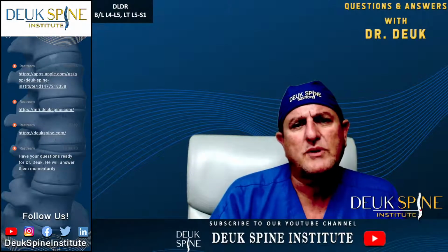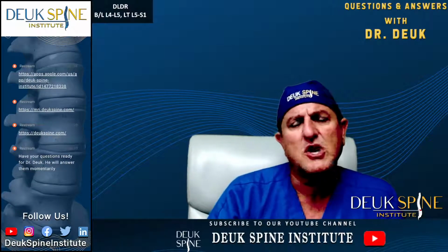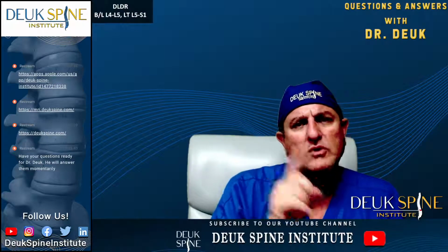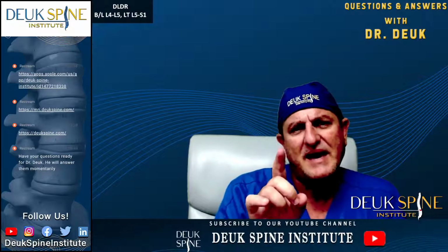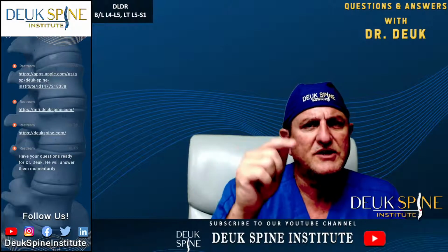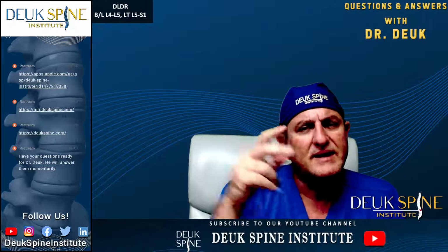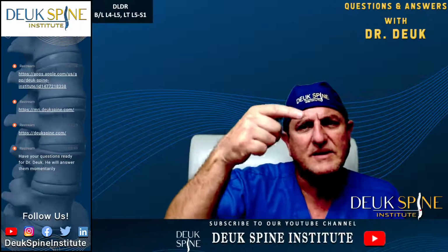We've treated now 20 patients with the Deuk laser disc repair for thoracic disc herniations with horrible pain in their thoracic spine. And all 20 patients have had 100% relief of the pain from the disc herniation that we treated. One patient, I couldn't get to one of their herniations. I wasn't able to fix it. So that one patient who had 2 thoracic disc herniations, we fixed one of them. They have no more pain there. Couldn't get to the second one.